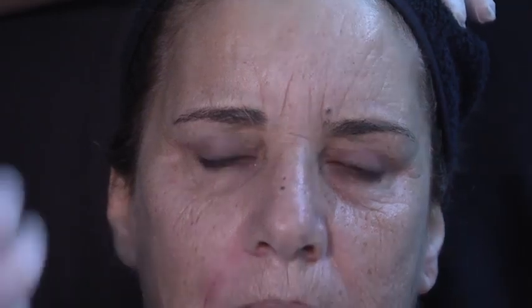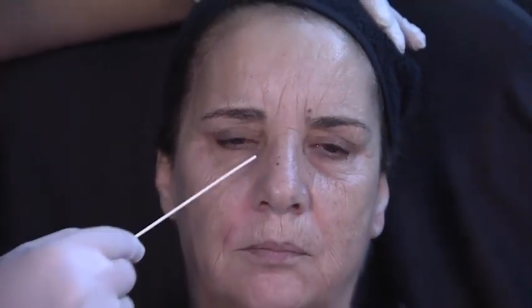Now, she is a person that has thick skin, and she has a very deep tear trough and palpebromalar groove. The amount of product that I will need with Vital Light is too much. I don't want any product to be injected in this area that I need more.